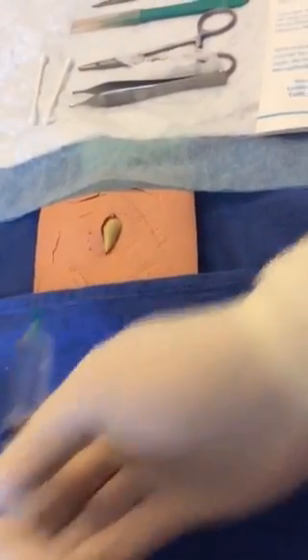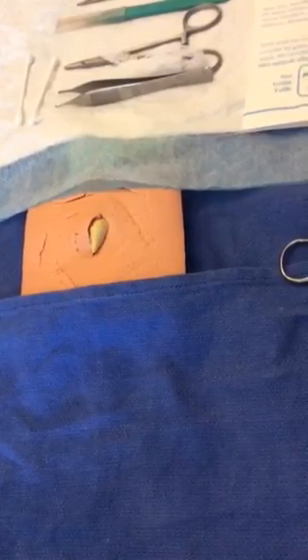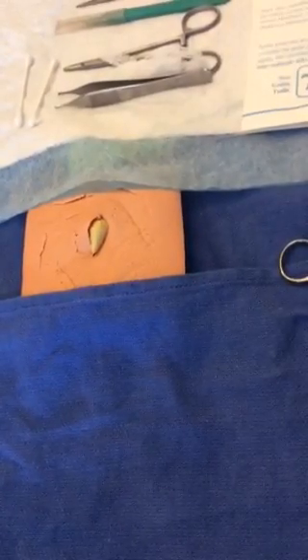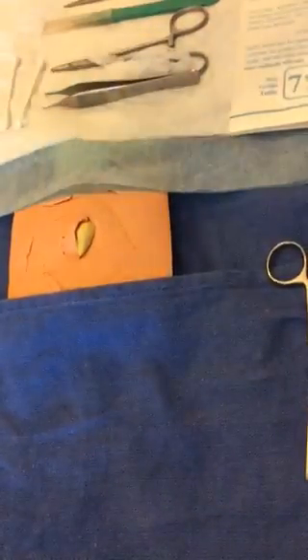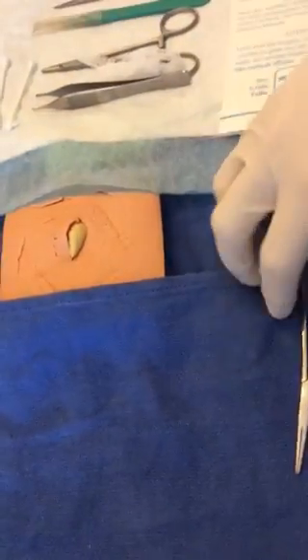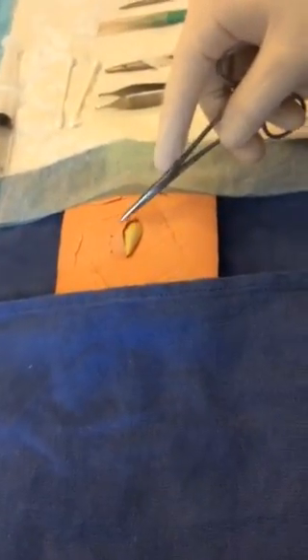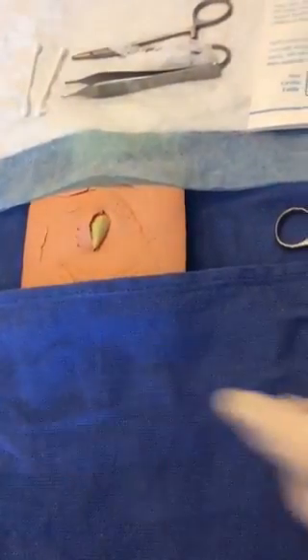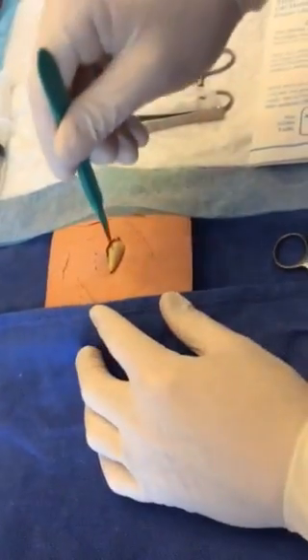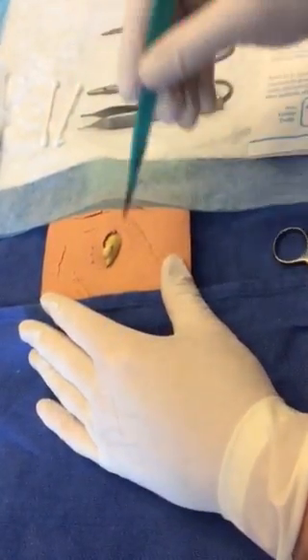So now that we have numbed the patient up, we will put our needle to the side. This takes about 5 minutes to actually set in. But in the interest of time, we'll pretend that it's been 5 minutes. I will touch the incision site, asking the patient if they feel this. When they say that they do not, I will then take an 11 scalpel blade and I will make an incision right here in the middle of the abscess. And as you can see, it will start to drain.